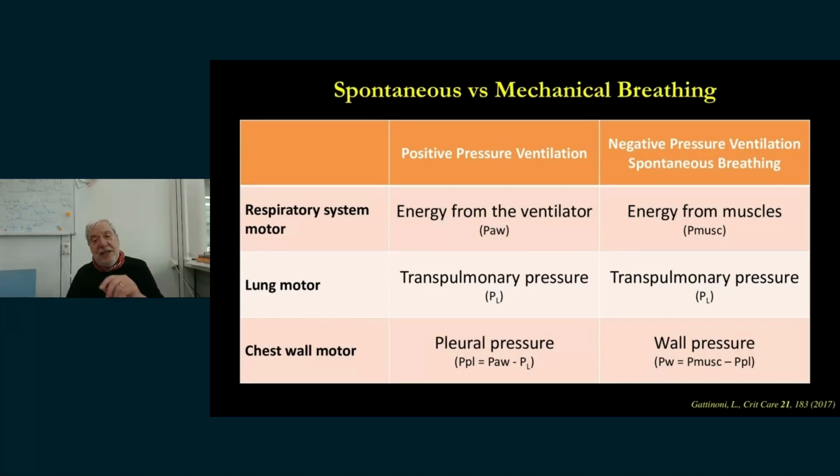Now, just consider this slide, which I think is quite important. Let's say I have a patient in mechanical ventilation. Where does the total energy to move the respiratory system in the patient come from? It comes from the ventilator. Let's say the patient is paralyzed, heavily sedated, unconscious, etc. So all the energy comes from the electrical energy that I pay for.